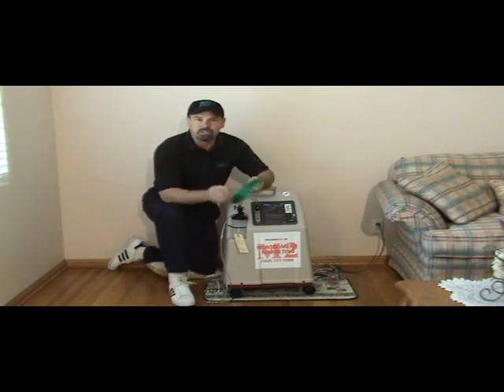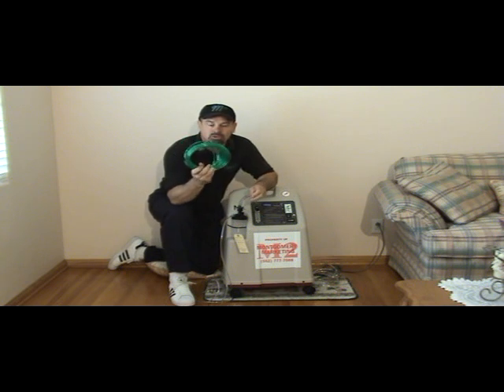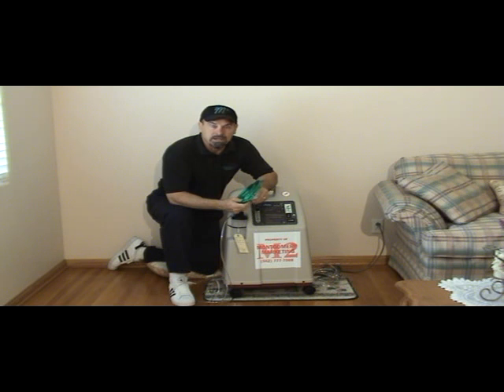We have tubing that comes in two lengths. There's a 20-foot length, which is what this one is, and a 50-foot length. 50 feet is the maximum you can provide to a patient according to the manufacturer's guidelines. When you provide 50 feet of tubing, you're actually also losing about 1 liter of flow. So if you have the patient on 4 liters of oxygen and you have them on 50 feet of tubing, they're actually only getting 3 liters. So you need to keep that in mind. 20 feet of tubing is not a huge deal.